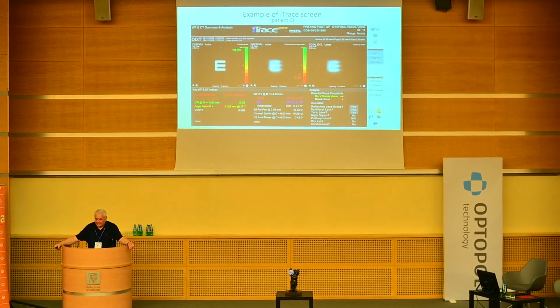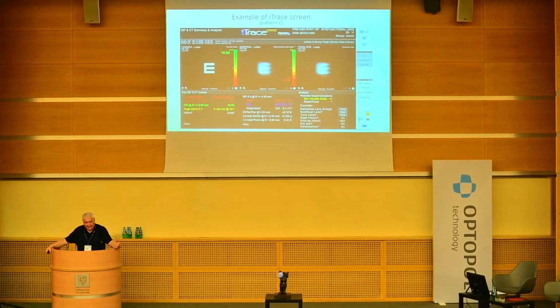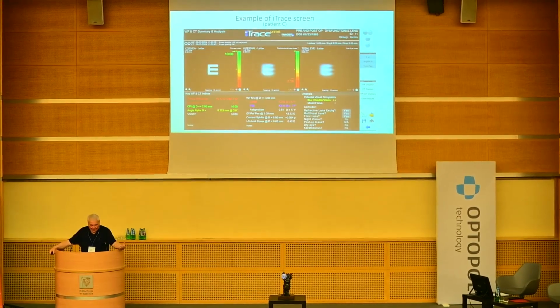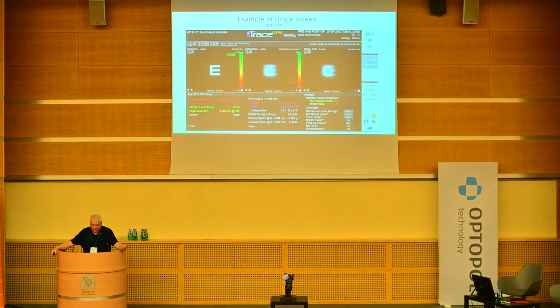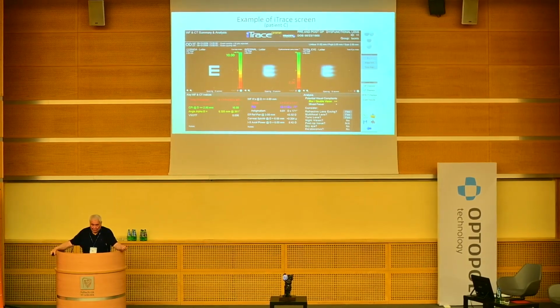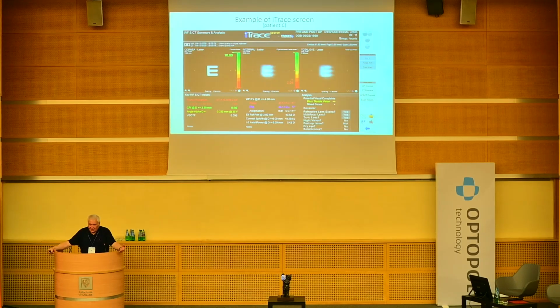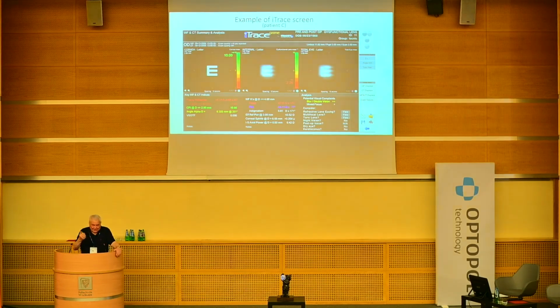How will you get it? You get it from subtracting the corneal component of wavefront from the total wavefront. But when you were acquiring these two data, you had different positions, because you positioned for wavefront and you positioned for the cornea.